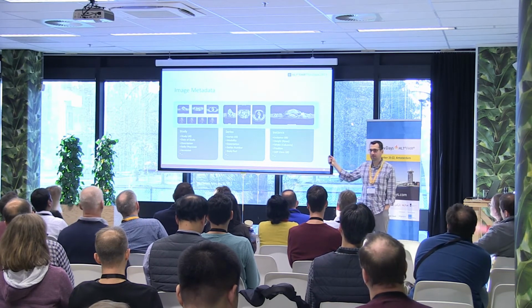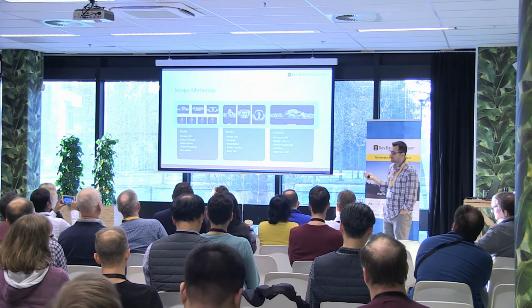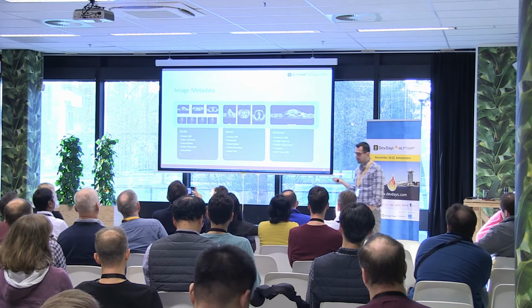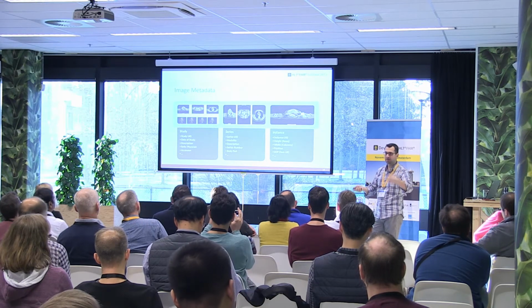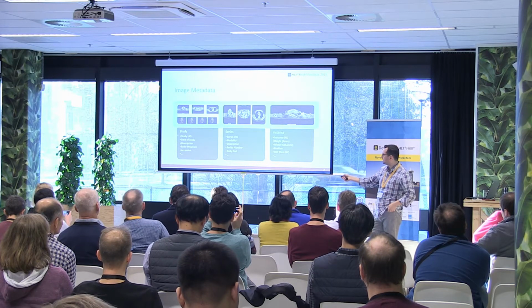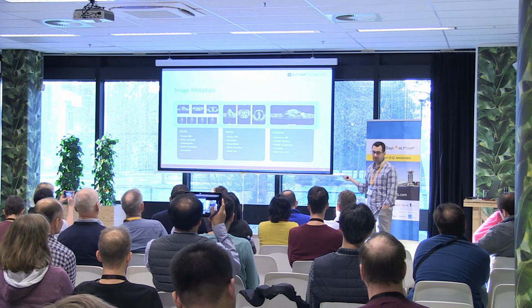Within DICOM, we heard the talk today about the metadata. It's not just the image. Again, DICOM also manages metadata that is attached to the image. In fact, I would say DICOM is even more about the metadata than it is actually about the image. So some attributes of interest: we have a study UID. UID is just simply unique ID.